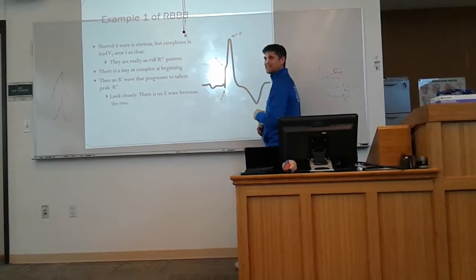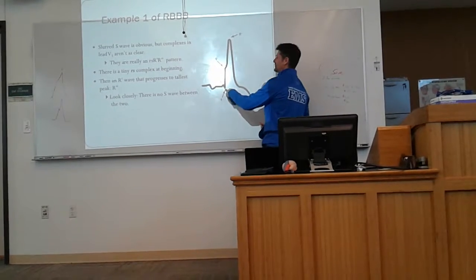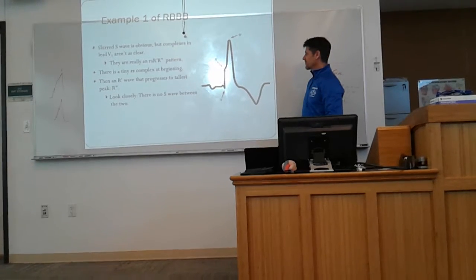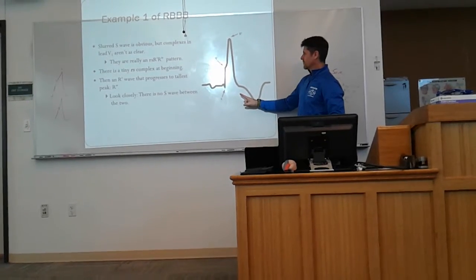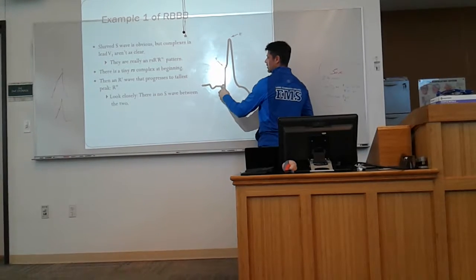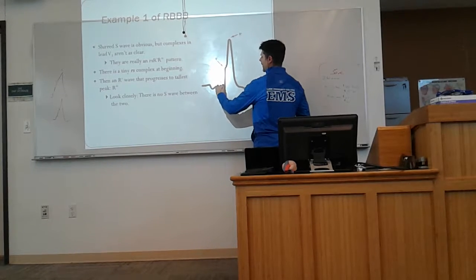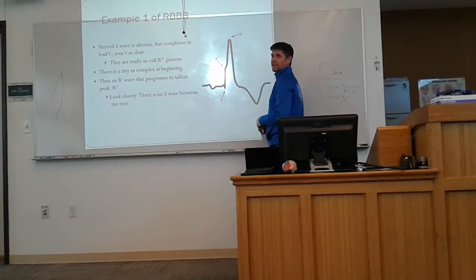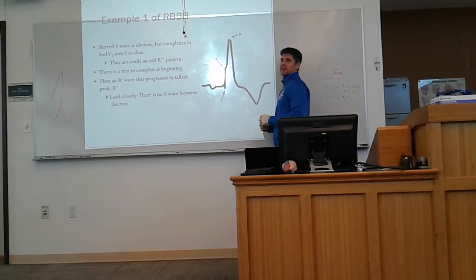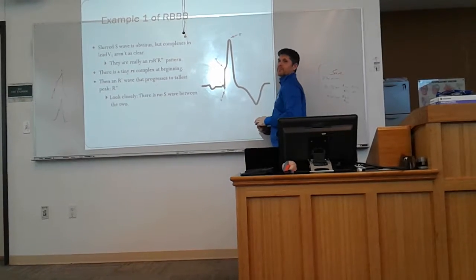And so that's an R wave, followed by this wave, followed by an R prime and an R double prime. And you're counting that little wave out to make sure it's not pathologic? The R and the S? Right here, this is not a third the height of the R wave, and there's no white space in there, which means it's not greater than 0.03 seconds, so that's not pathologic. And that's an S wave anyway, not a Q wave.